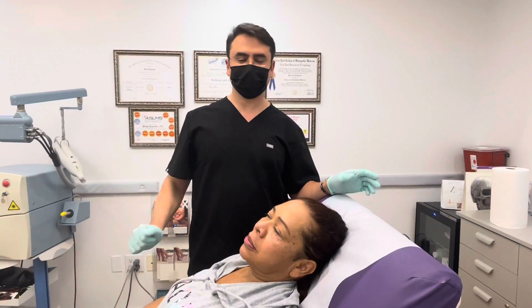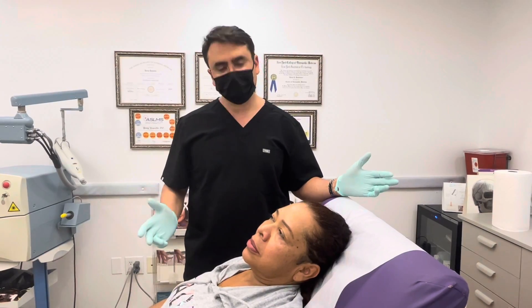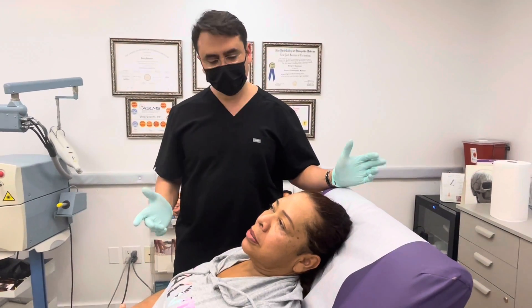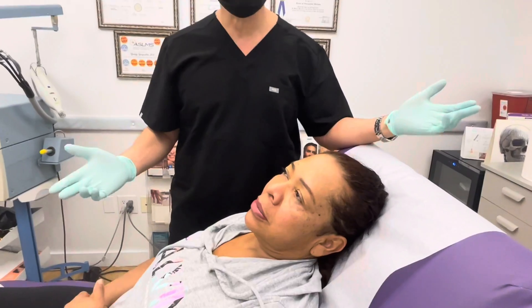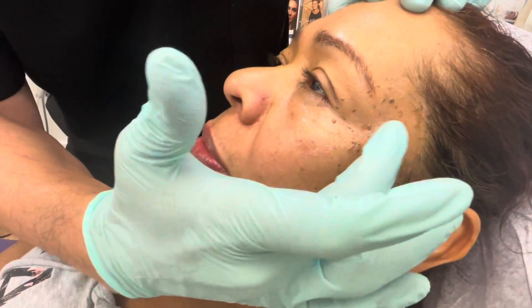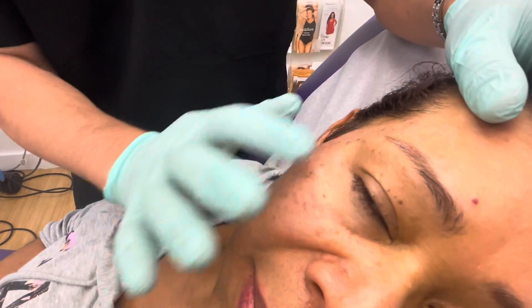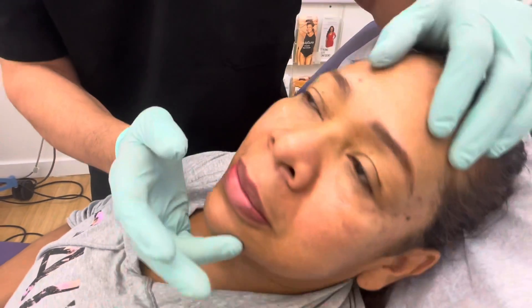Today we're going to talk about the procedure radiofrequency treatment of seborrheic keratosis — the layman's term is called skin tags. You can see this client, for example, she has some raised little discolorations on this side and on this other side. She's already been prepped and anesthetized with lidocaine injections and topical lidocaine.